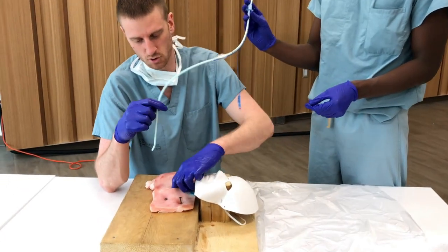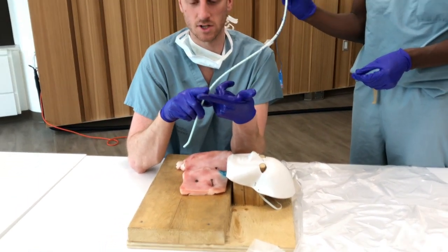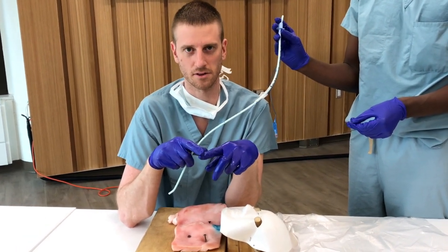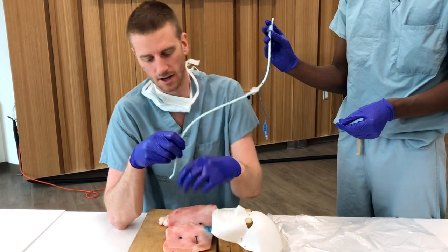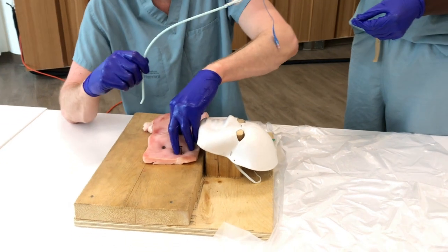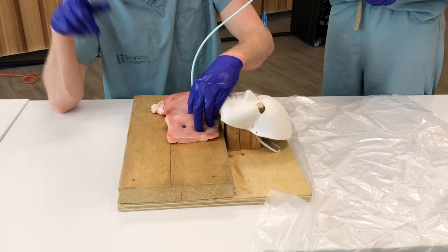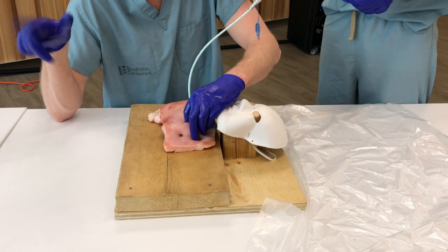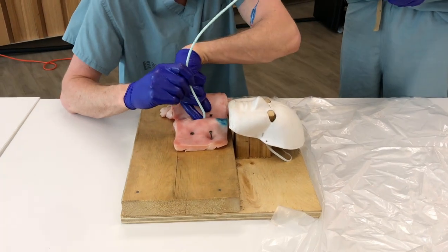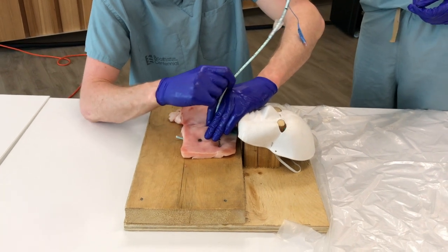And you're going to see I've got some choices in terms of how I put this bougie in. If you think about your finger, you've got a lot of sensory information along the pad of the finger and a lot less on this hard, epithelial, keratinized thing we call a nail, right? And so we're always going to pass the bougie along the pad of the finger and benefit from that sensory information, okay? And this feels a lot like doing a chest tube. Your finger is into a potential space there and you're able to get a lot of tactile feedback, okay? So passing the bougie along the pad of the finger and into the trachea is how we do this, okay?